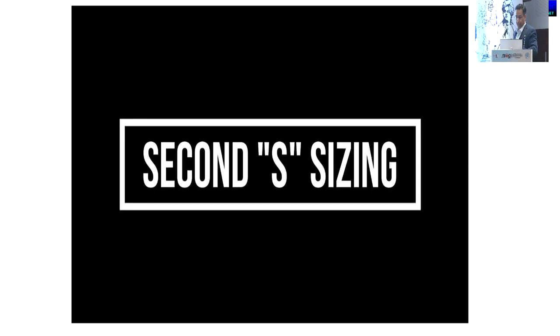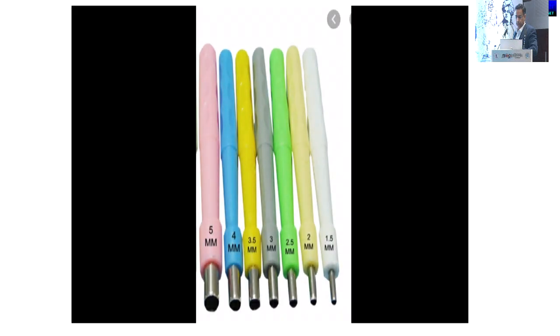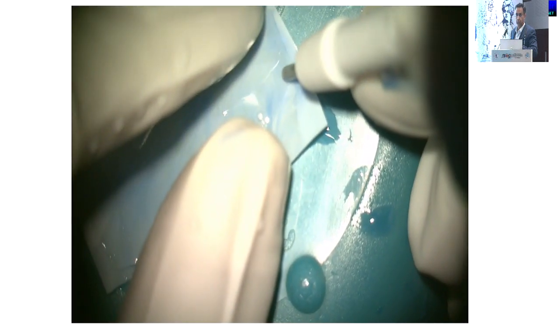Second S, sizing. We need to determine the graft size and then cut it neatly and accurately. We use inexpensive disposable dermal trephines. We measure the macular hole indices preoperatively on OCT B scan. After some trial and error, we found that the optimal graft size is roughly the average of the sum of the minimum linear diameter and the base diameter. See how easy it is to get the perfectly sized graft with a dermal trephine.